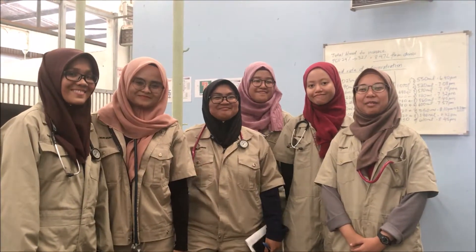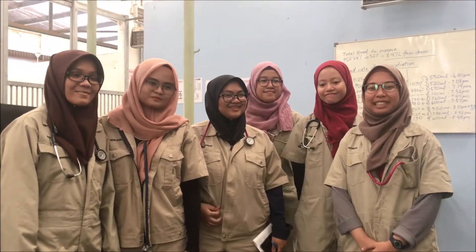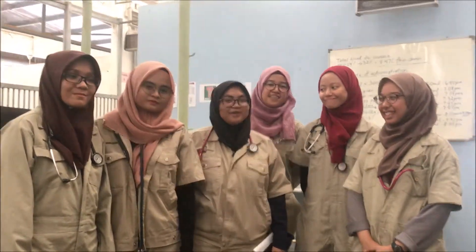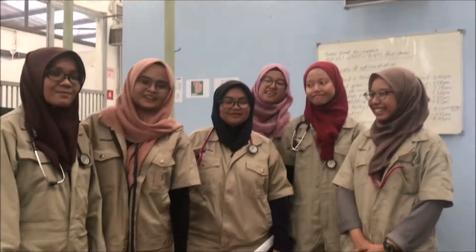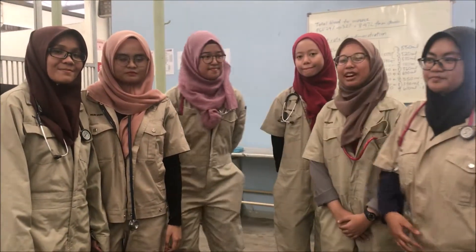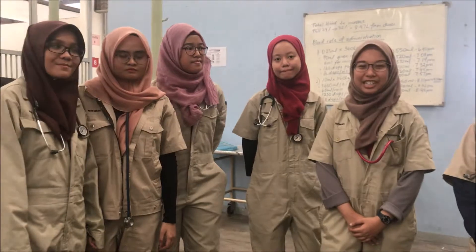Assalamualaikum, we're from group A. My name is Fatima. My name is Kusmina. I'm Akilah. Hi, I'm Yuzmin. My name is Arina. And today we are going to perform percussion plus auscultation.